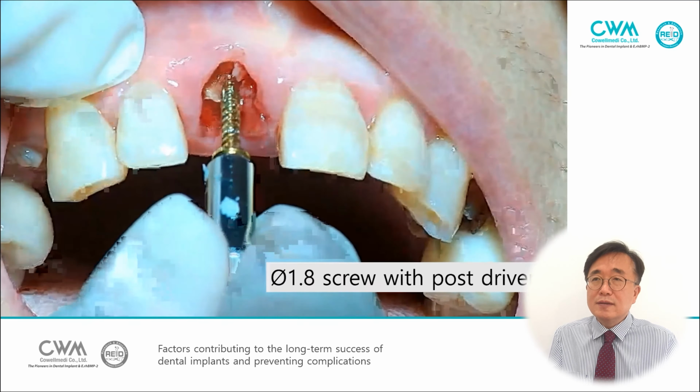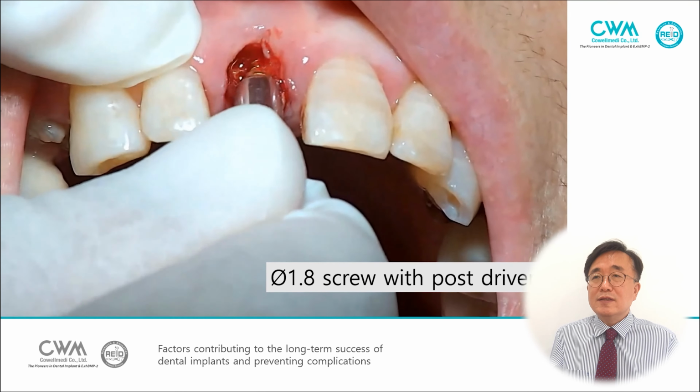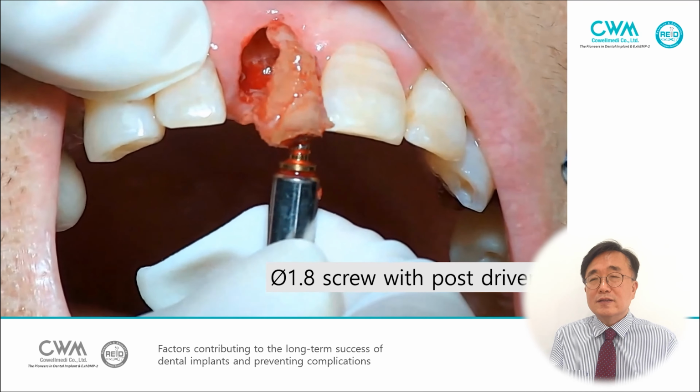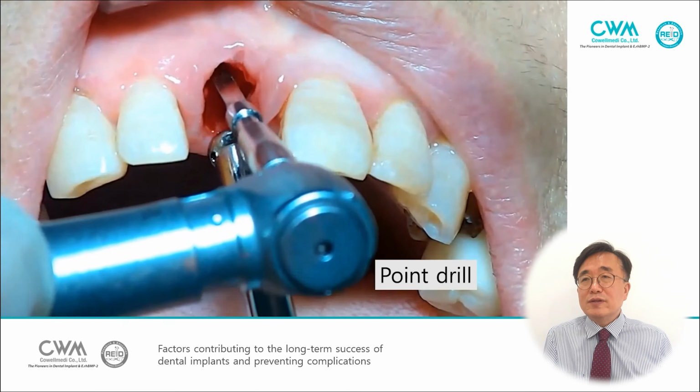and then a 1.8 screw is inserted, and luxated, extracted, and the implant drill is used.